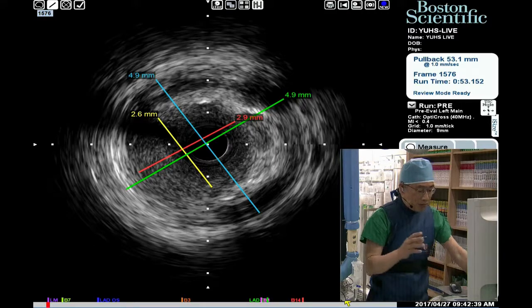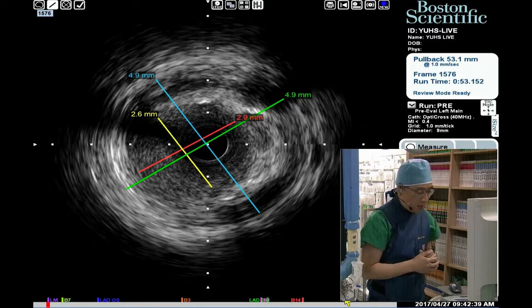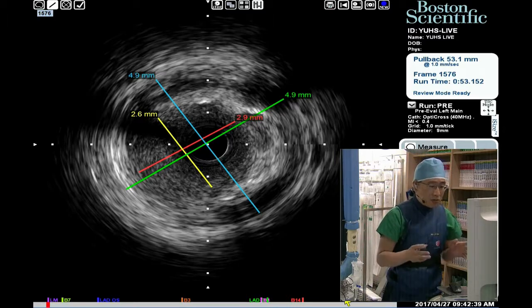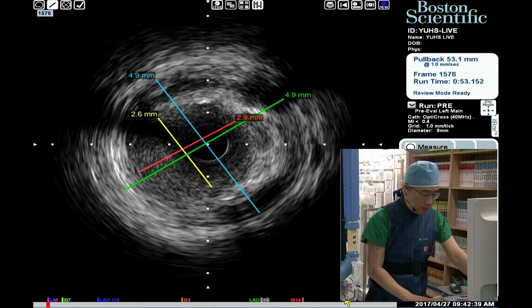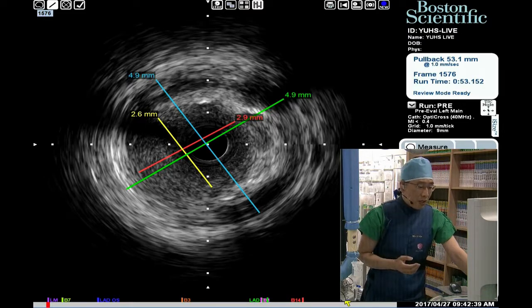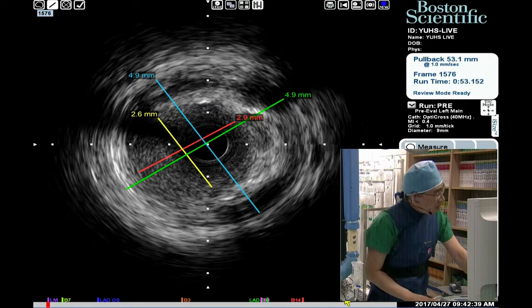So there is a lot of discrepancy between the distal part and the proximal part, because distal is a mid LAD and proximal is a left main ostium. So we will cover between the mid LAD and the left main ostium. In this patient, I think it is very important to use IVUS guidance because we have to appose the stent struts well, which can improve the stent deployment process.